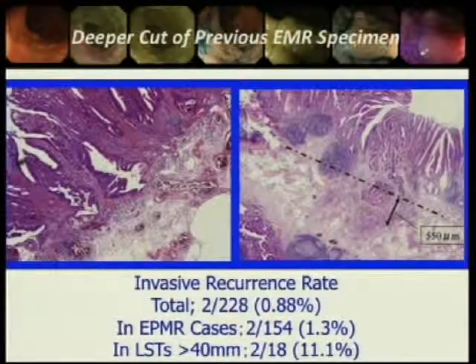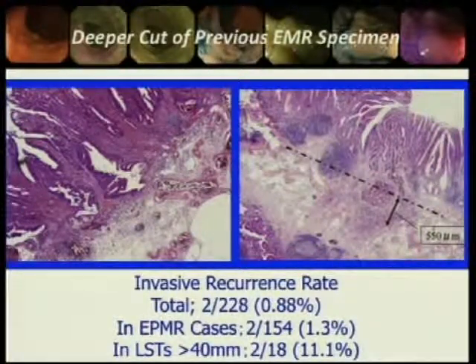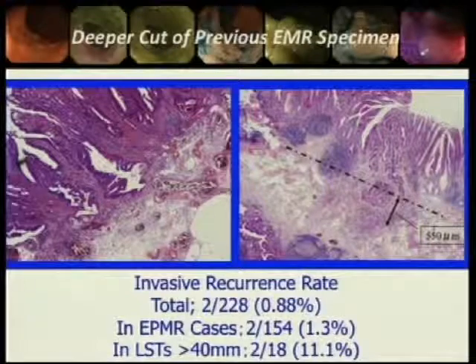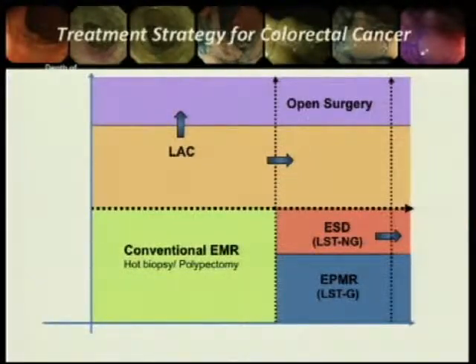This kind of invasive recurrence after piecemeal resection is very rare. However, focusing on LST more than 4 centimeters, the recurrence rate rises to more than 10%. So we cannot ignore this invasive recurrence rate. So recently, we have expanded the ESD indication not only to LST non-granular type, but also to LST granular more than 3 centimeters or more than 4 centimeters.